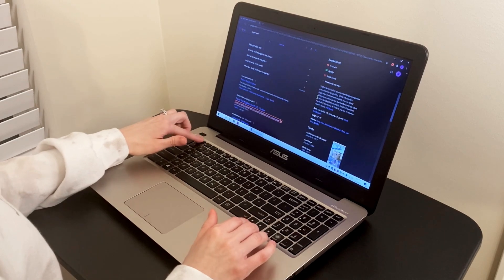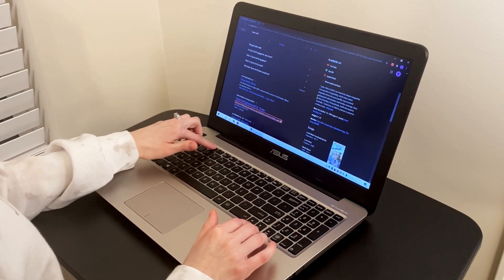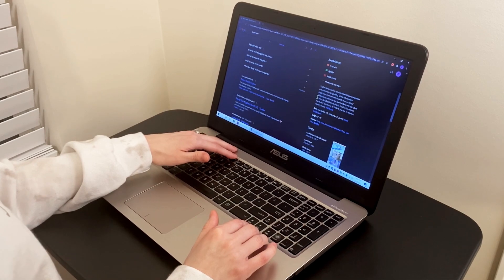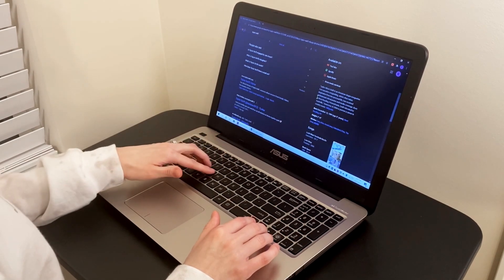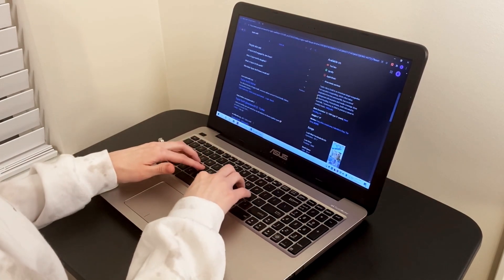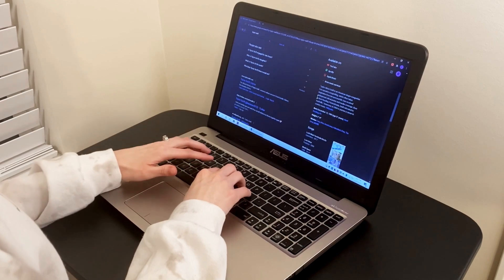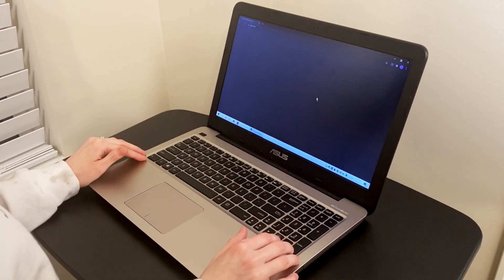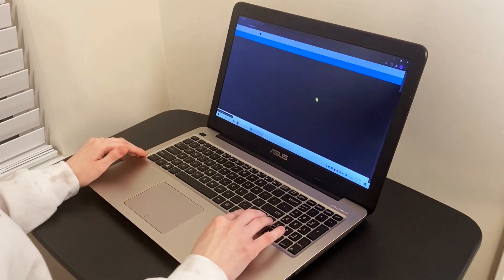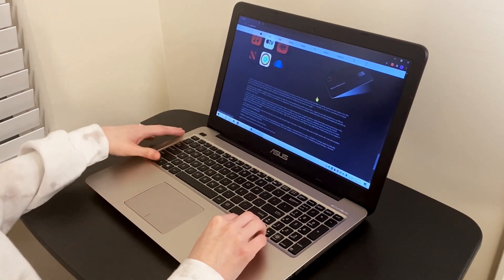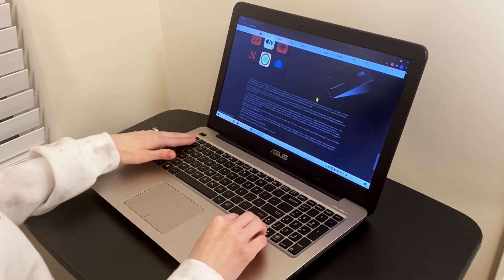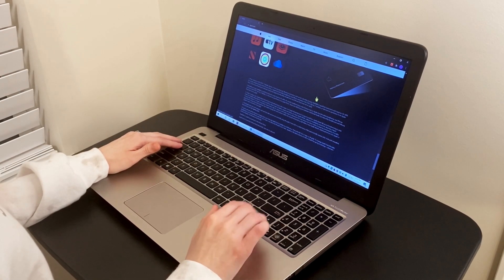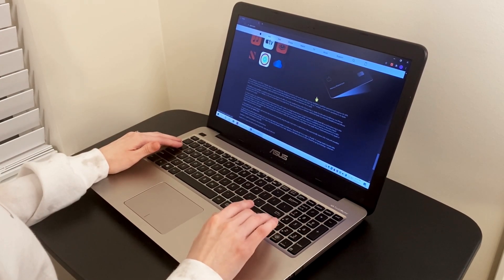To go to a specific website, I hit F6 to put me up in the address bar, then type the URL. Let's go to apple.com. I can use Tab to navigate between different buttons, or use arrow keys to navigate line by line.